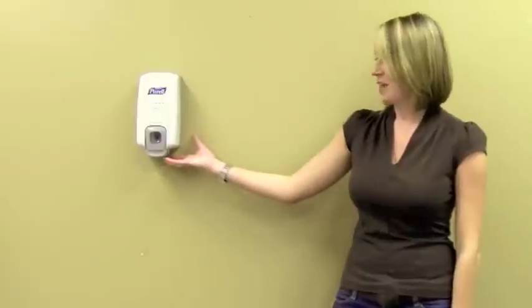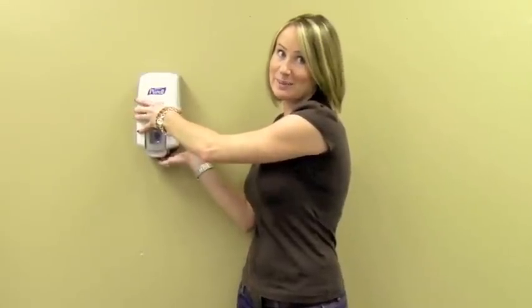Hi, it's Kathleen from Market Lab. I'm going to demonstrate how you can refill your Purell NXT dispenser. The dispenser has a button at the bottom behind the hinge. When you press it, it moves up to release the locking mechanism at the top.